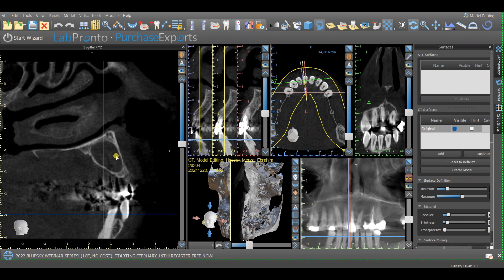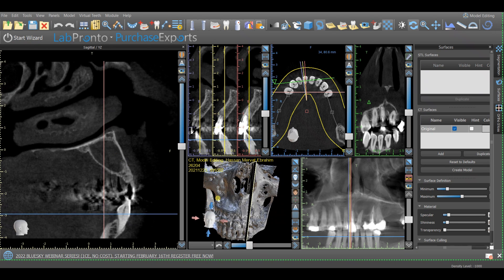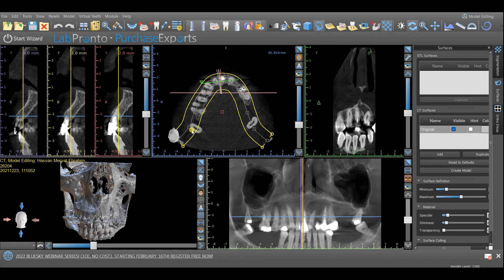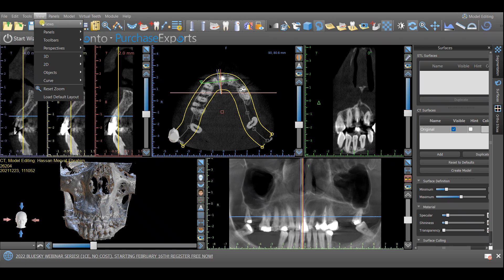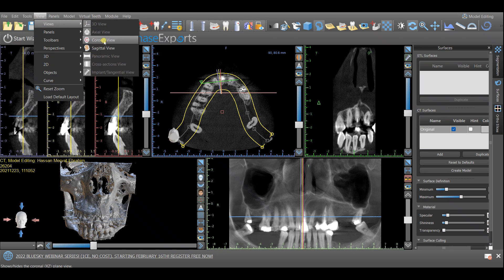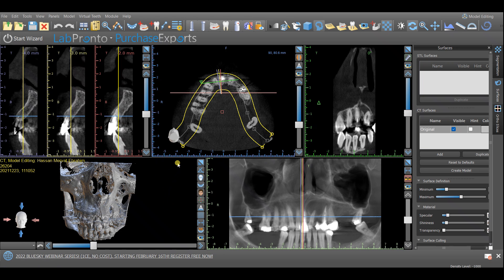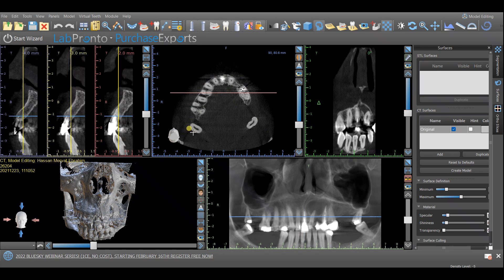It basically moves mesial and distal. Let's go to View > Views and choose coronal, sagittal, and so on. If you want to draw the panoramic curve, you will go here, draw the dental curve, and you will just point in the middle of the tool.